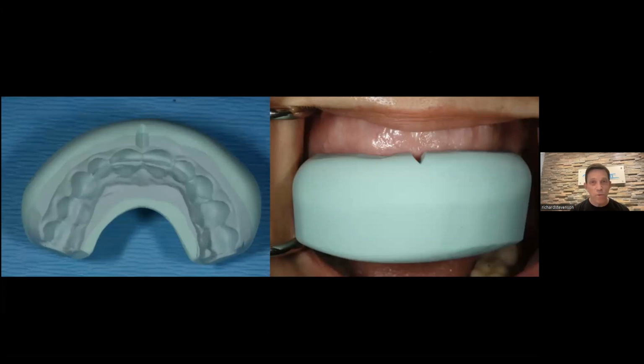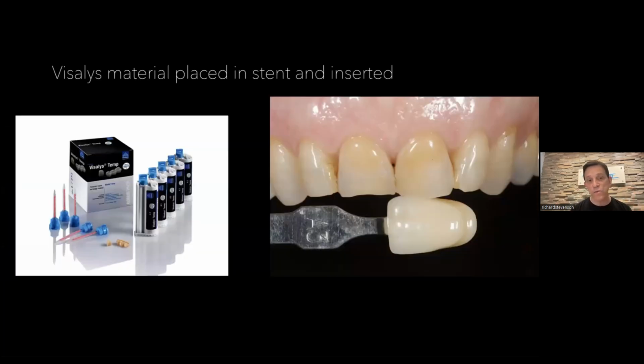So we're in this interesting time where we're all looking at these kinds of things to do, and they're not always smart, okay? Sometimes you're not going to change the facial position of the veneer, and it should only add. So be careful what your lab does, because sometimes labs will just add more to the facial and bulk the teeth out. In her case, we needed to add more to the facial, right? Because her teeth needed to come forward. And so we're kind of doing a little bit of instant orthodontics in these kinds of situations.